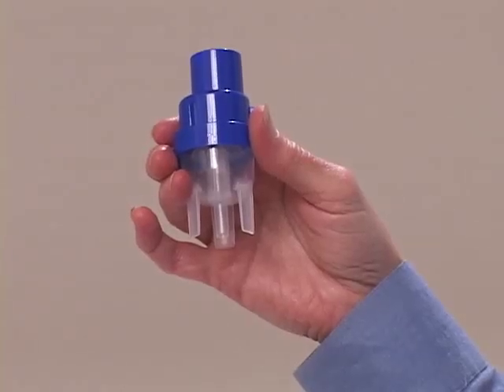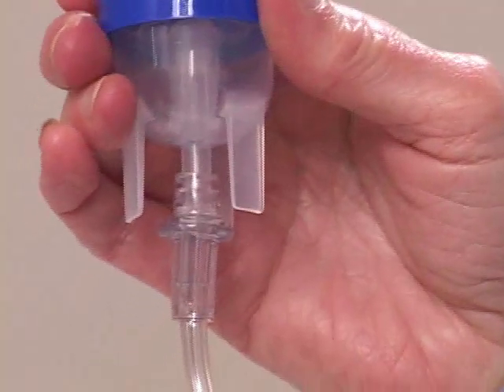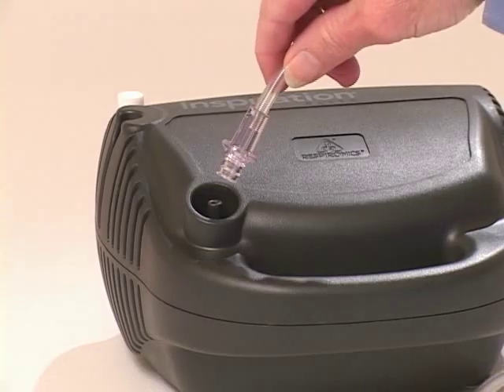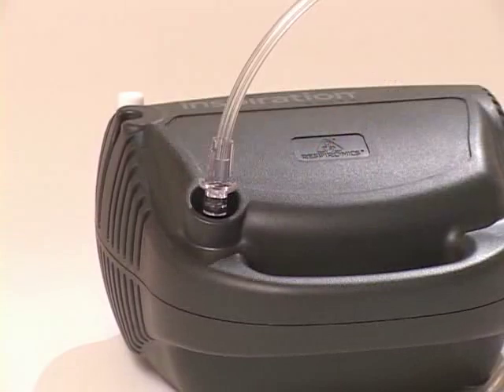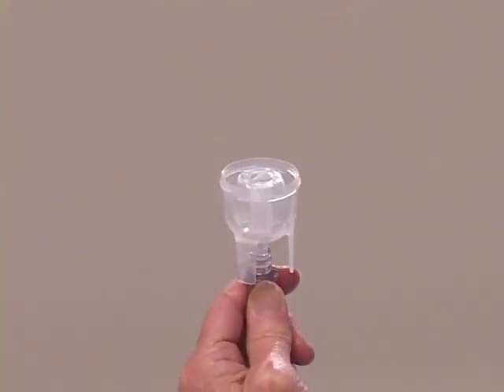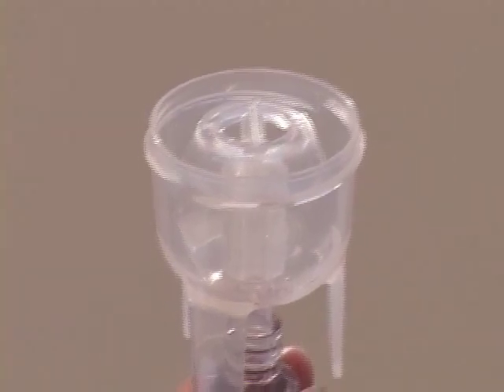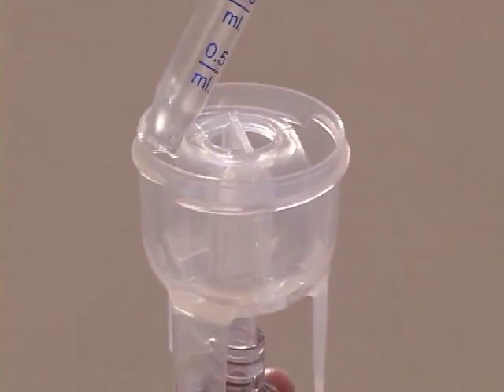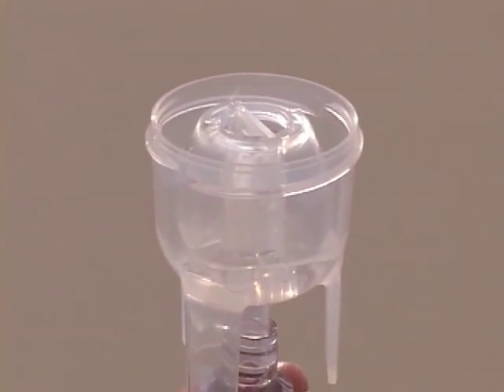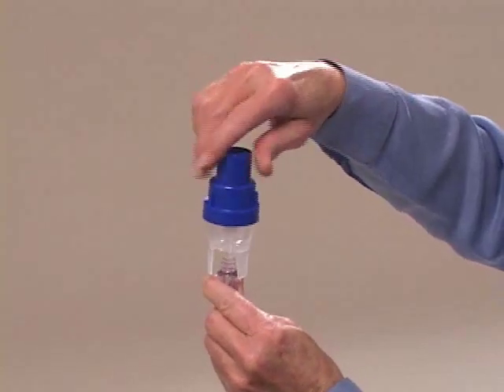Begin by connecting the plastic tubing to the bottom of the medicine cup. Both ends of the tubing are the same. Connect the other end of the plastic tubing to the compressor. Remove the dark blue cap from the medicine cup. Your medicine should be added to the nebulizer as prescribed by your health care provider. Be sure to add the medication along the side of the cup, not the center. Ask for assistance if you're not sure of the amount. Put the cap back onto the medicine cup.